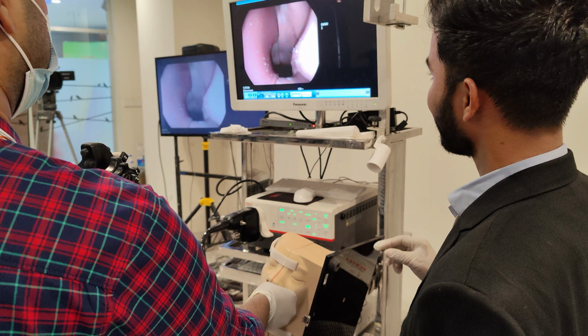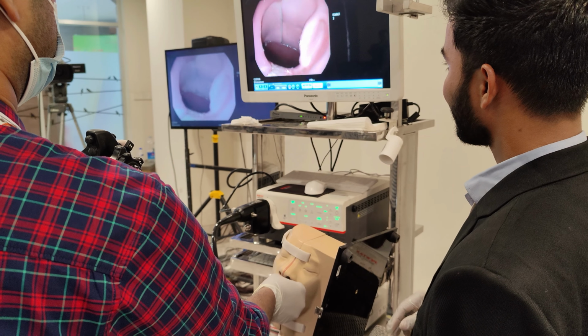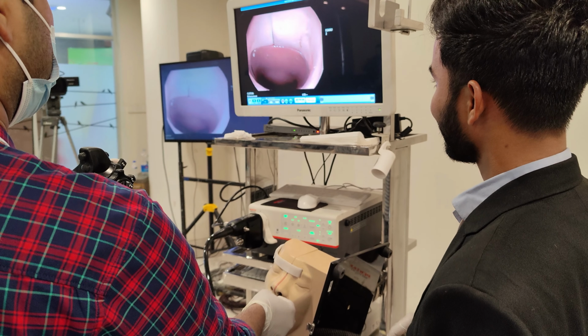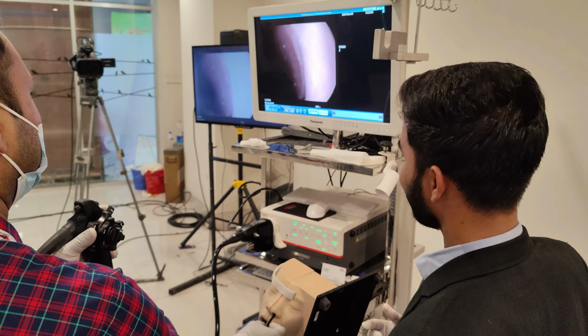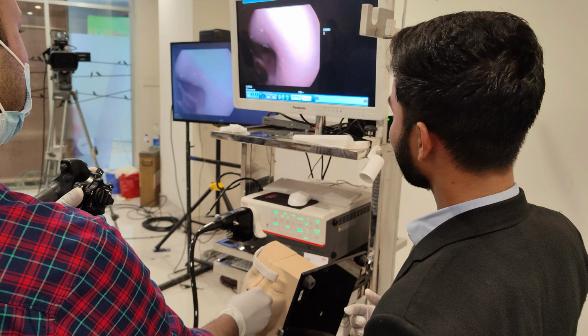Then I am advancing the scope along the floor of the nose. Then when I am at the nasopharynx, the scope is directed downward. Now we can have a view of the larynx. Here we can examine the larynx, the piriform sinus.